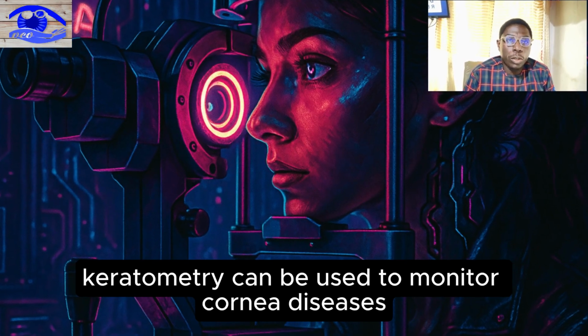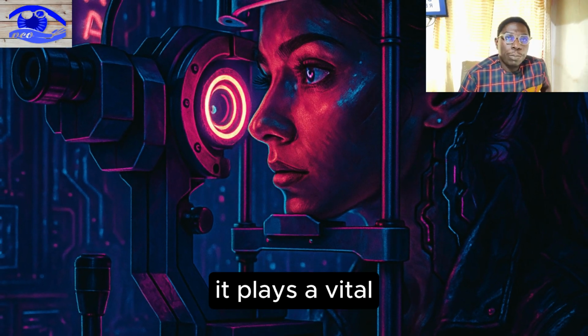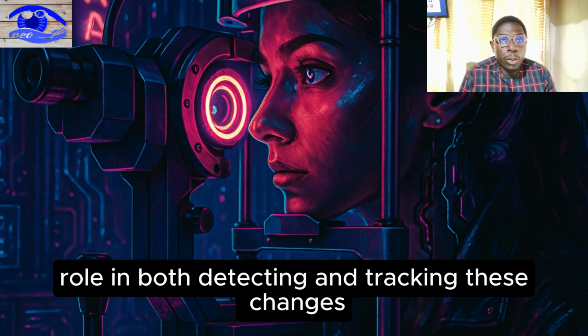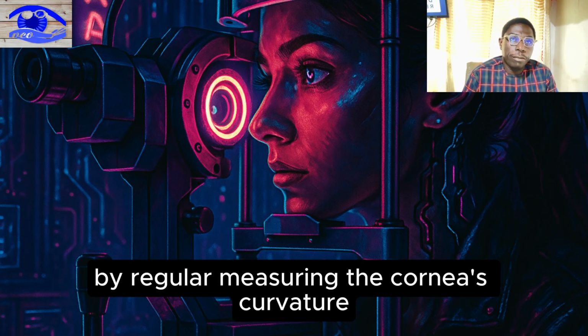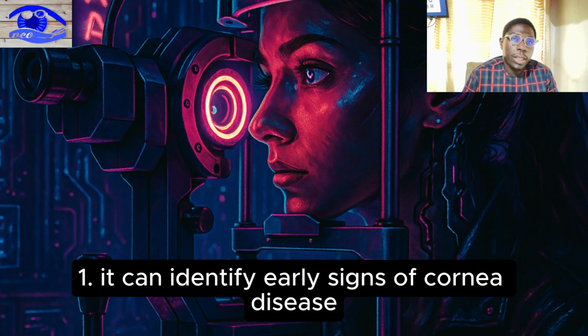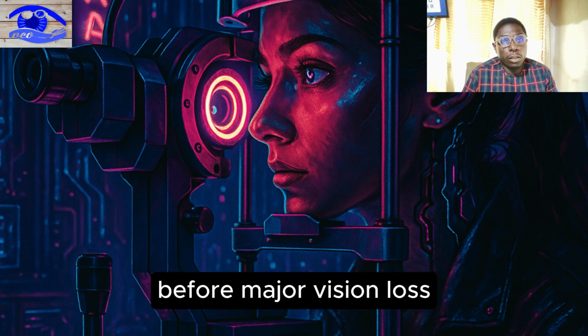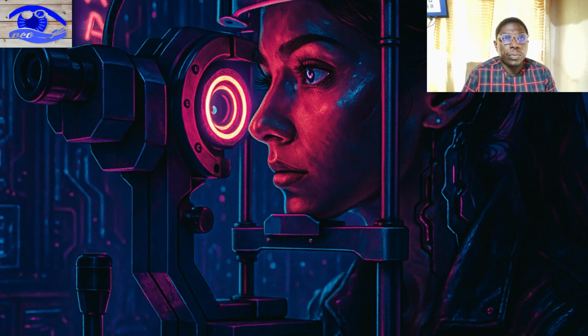Keratometry can be used to monitor corneal diseases. It plays a vital role in both detecting and tracking these changes. By regularly measuring the cornea's curvature, eye care professionals can identify early signs of corneal disease before major vision loss, and monitor how quickly the condition is progressing.